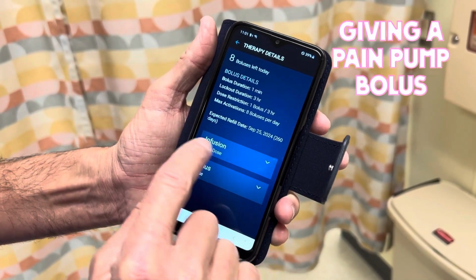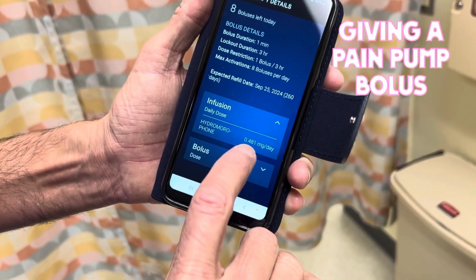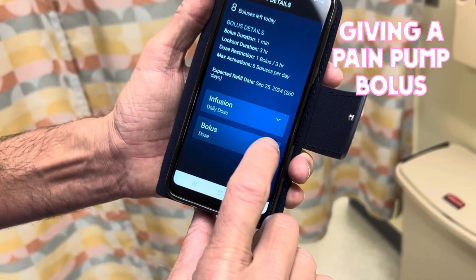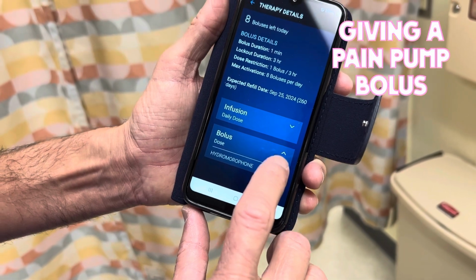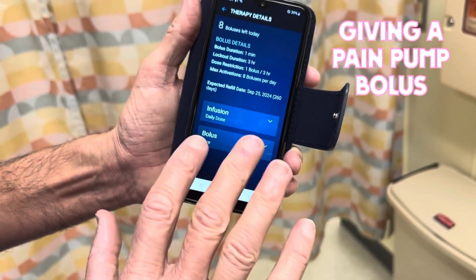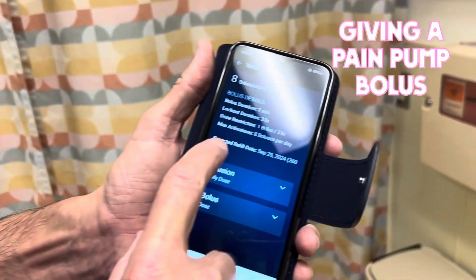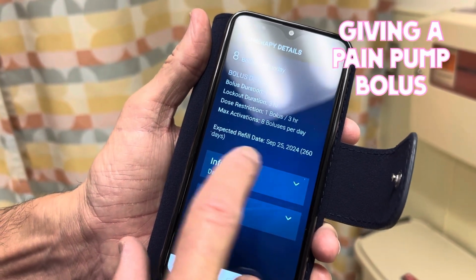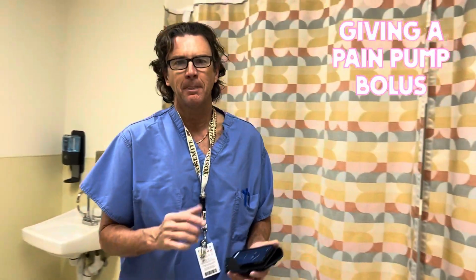If you go here to where it says infusion daily dose and you tap that, it tells you the dose of medication that you're getting per day. And if you tap where it says bolus dose, it tells you the dose of bolus that you're getting per dose. Then the most important part, if you're trying to understand when your pump's going to run out, if you look here, it says expected refill date, September 25th, 2024. So that's 260 days. That's how you can always tell when it's going to run out.